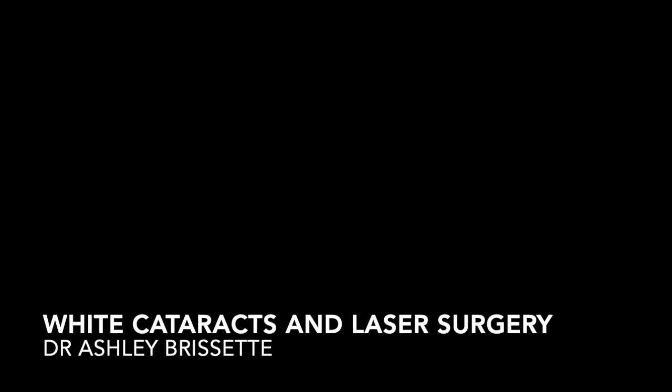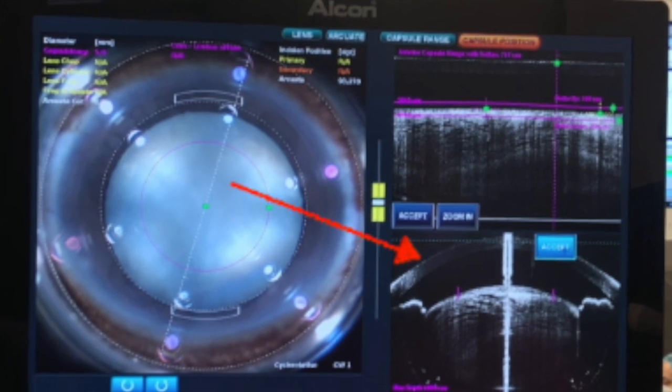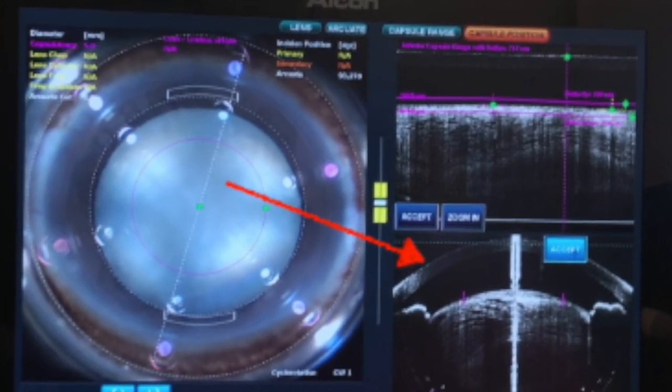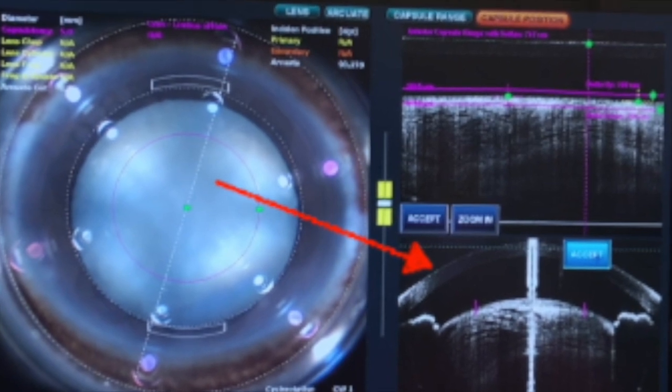Hi, this is Dr. Ashley Brissett showing you the use of femtosecond laser-assisted cataract surgery for white cataracts. You can see here with white cataracts, the lens is often very intumescent and highly pressurized, which leaves you at high risk of the Argentinian flag sign.